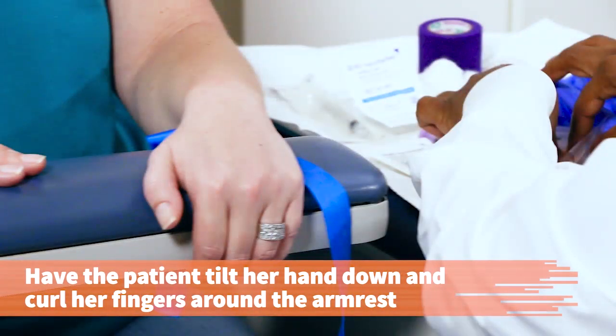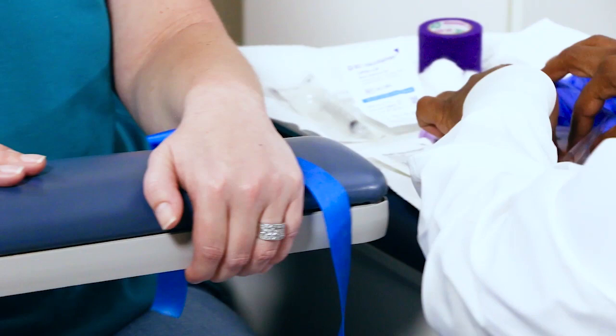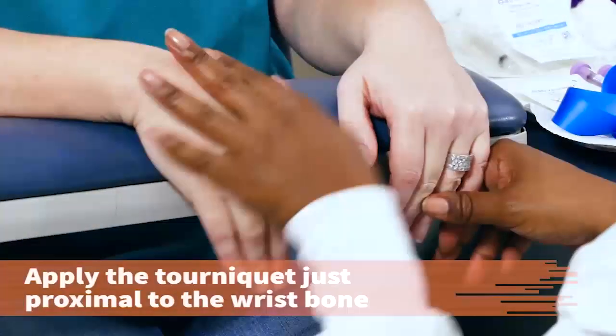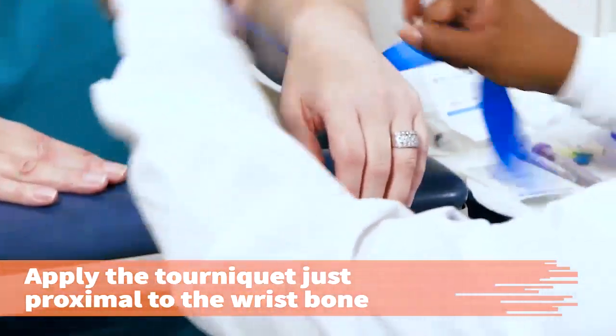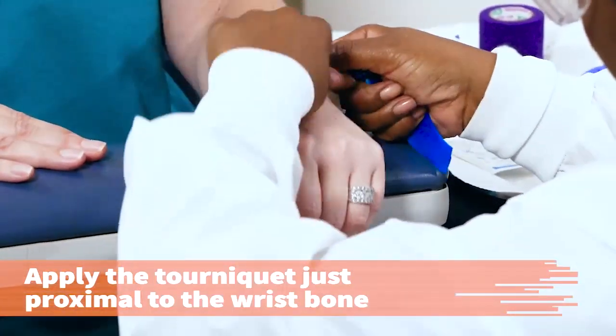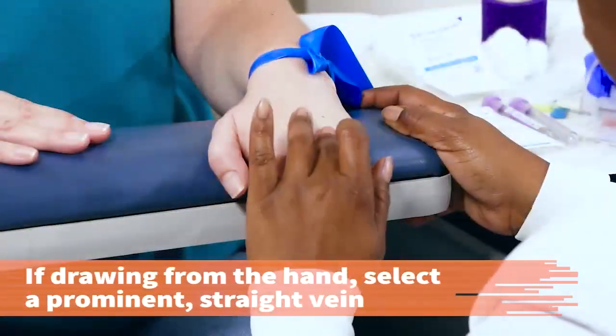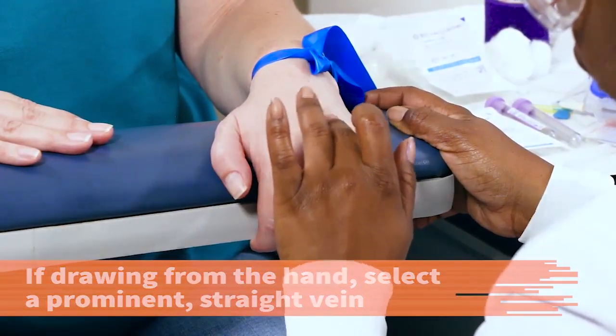If drawing from the back of the hand, have the patient tilt her hand down and curl her fingers around the phlebotomy chair. Alternatively, have the patient place her venipuncture hand open over the other fisted hand with the fingers lower than the wrist. Apply the tourniquet around the wrist, just proximal to the wrist bone. Do not apply the tourniquet so tightly that blood flow in the artery is impeded. Select a vein on the back of the hand that is prominent, stable, and straight as possible.